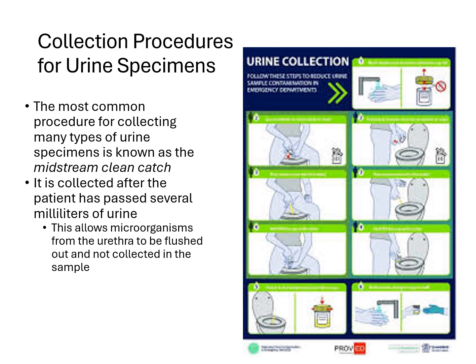So as you can see in the picture, there are different collection procedures for males and females. They just need to ensure that they are doing this appropriately to make sure that area is clean for when they are collecting their urine sample.